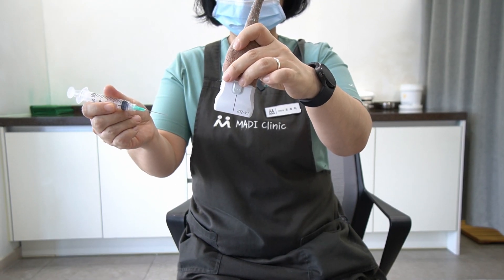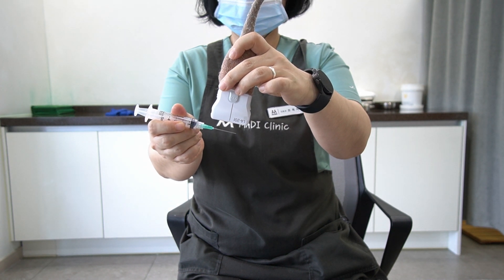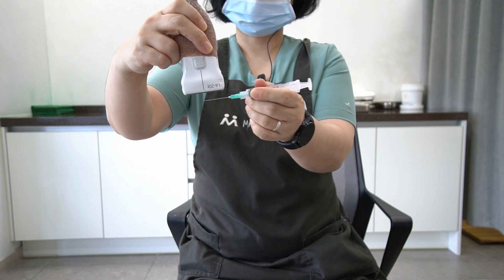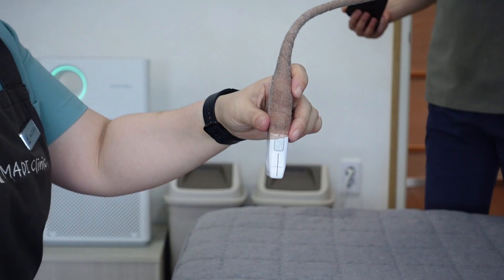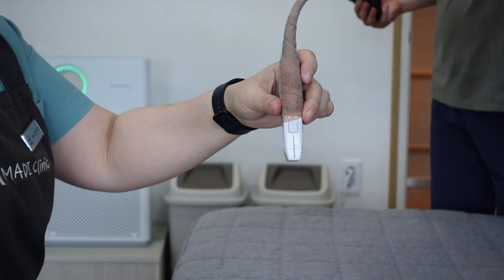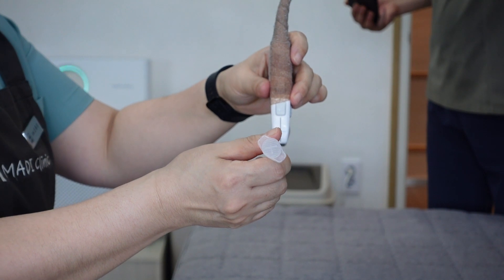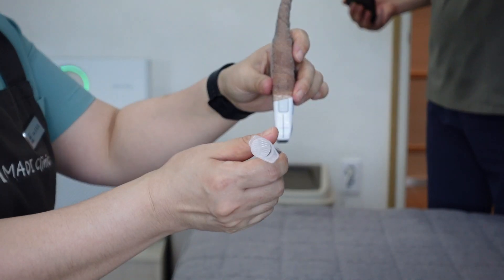First, hold the needle with the right hand and the probe with the left hand, moving horizontally from right to left. Second, hold the needle with the left hand and the probe with the right hand, moving horizontally from left to right. Following this, we've captured a close-up video of the needle's movement aligning with the ultrasound probe. The recording documents the hand and needle motion from the right lateral perspective.